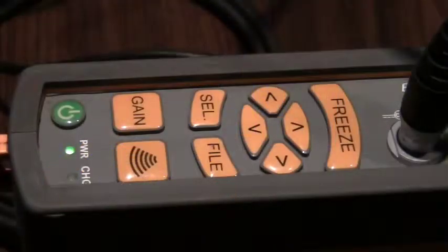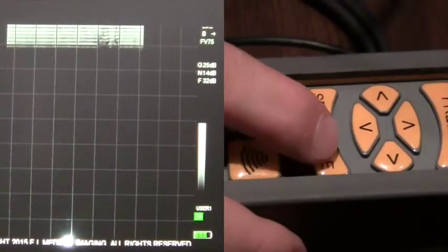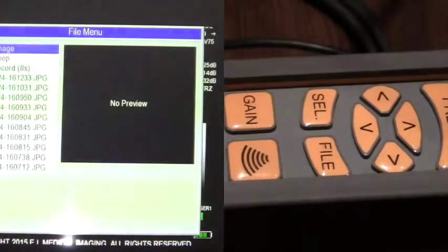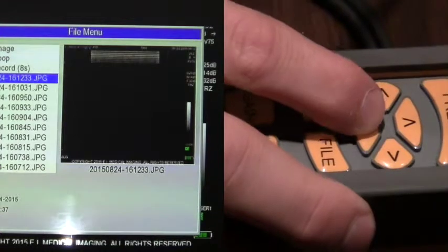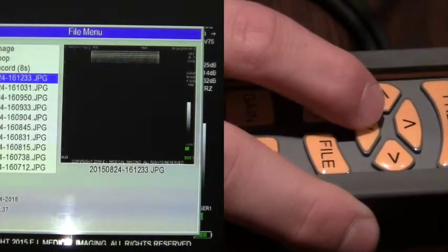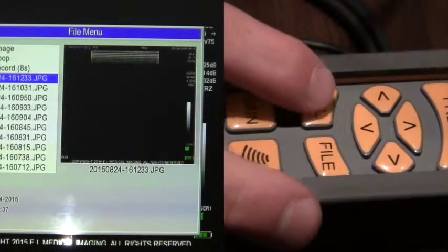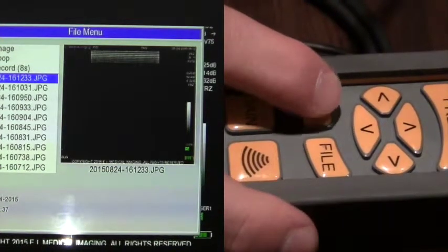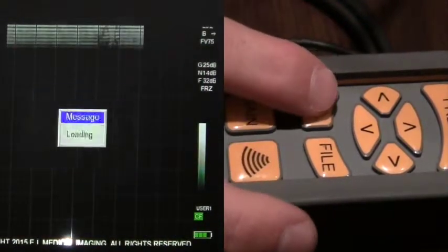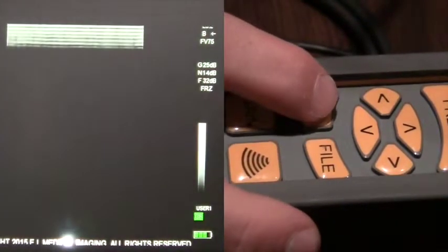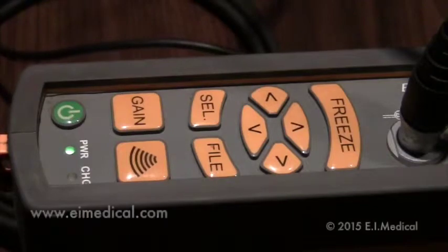To recall an image on the IBEX light from a live screen, hit the file key. Use the up and down arrows to select the image you would like to review. Once highlighted, hit select. Use the select key again to hit recall and your image will be recalled.